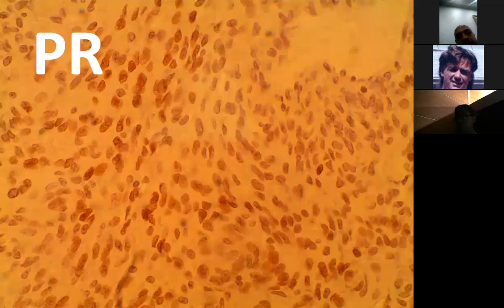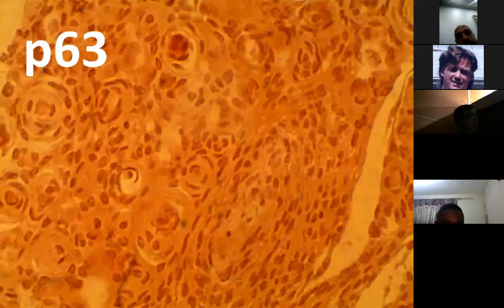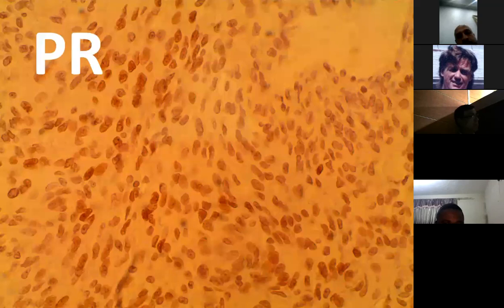Progesterone: usually meningiomas express progesterone, which increases growth, and that's why they're more common in females. In this tumor, progesterone was not very high. Some literature associates this with worse prognosis, but there is not a solid list of papers. So progesterone shows nuclear staining, but the expression was very low, less than 5% in this tumor, which is not the usual case. Usually there is a higher percentage of progesterone expression among the meningeal cells.